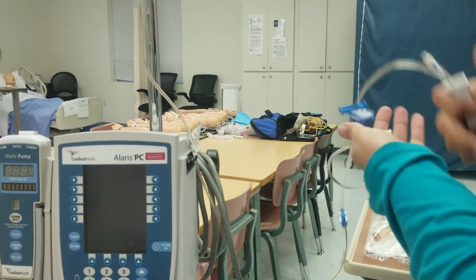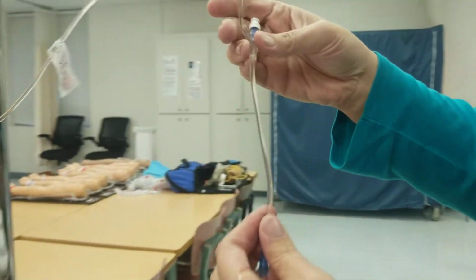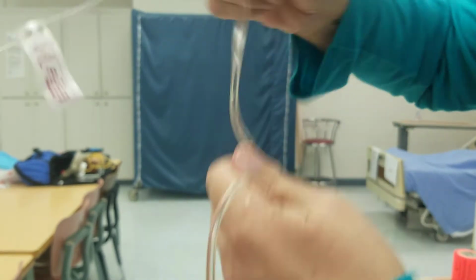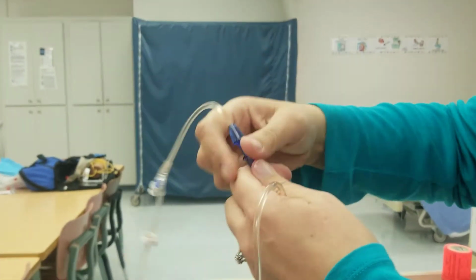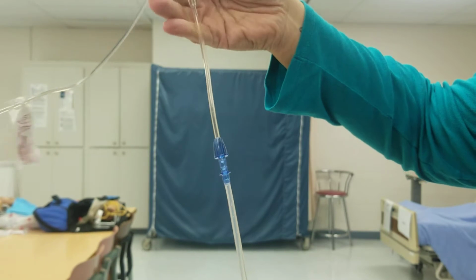All right, if you have a lot of bubbles, which I don't see any right here. Here's a couple. You can kind of see them. That's not going to hurt your patient. If you just want to get them out, you can kind of do that, and it makes the bubbles go up. Same thing with the tubing. See, there's some bubbles in there. See how they rise up and kind of get rid of them. They kind of dissipate.